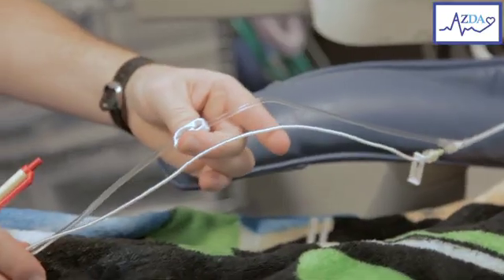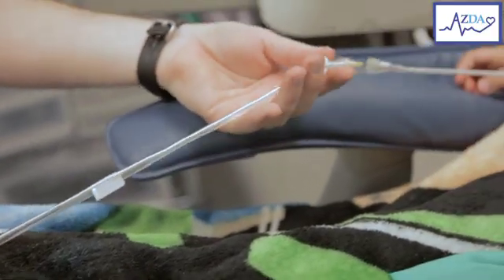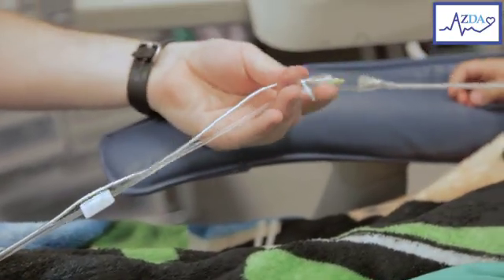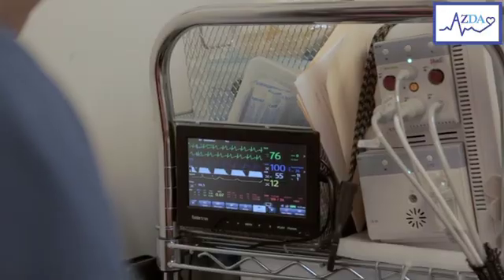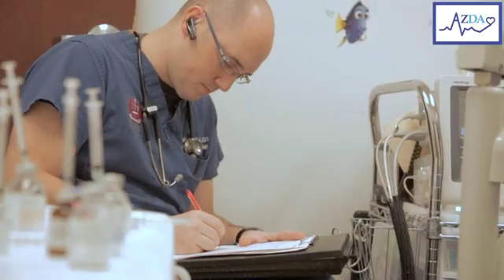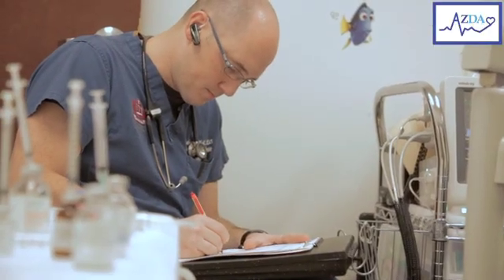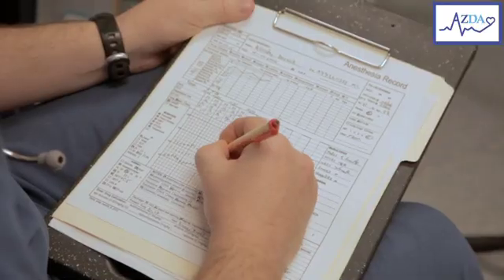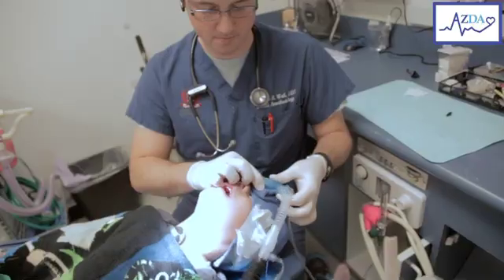With five to ten minutes left in the procedure, the infusion pump can be discontinued or tapered down. This way we can wake the patient up quicker and move on to the next case, therefore increasing our efficiency.